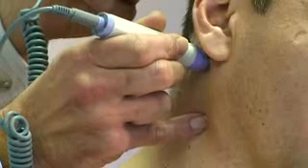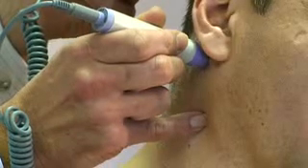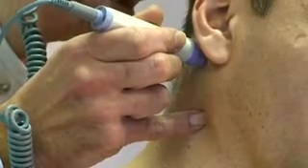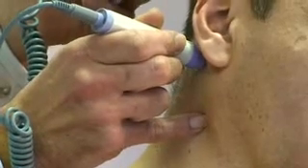We're now using the handheld Doppler to try and pick up the vertebral artery in the region of the C1-2 level, lateral to the spinous processes. We should pick up a sound — a normal pulsatile sound.